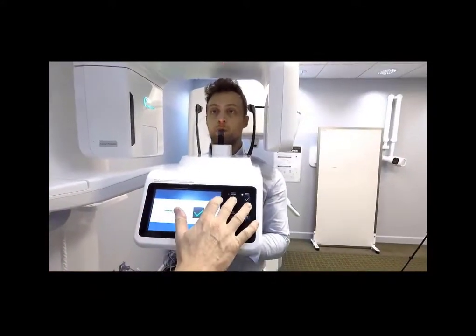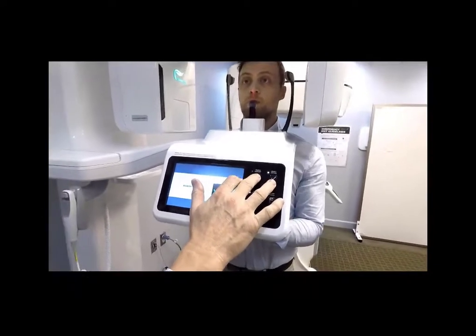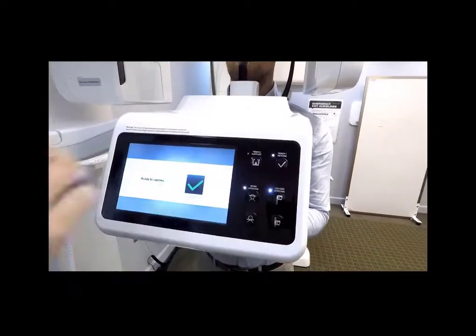Once the lights are projecting properly here, I can reach there in front of the control panel, again on the LCD screen. And what I want to do then is put the device into capture mode here. So the first thing I'm going to do then is close the temporal rods.